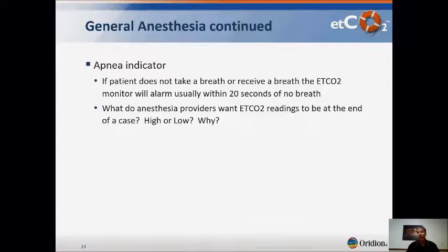So generally you want a higher CO2 reading at the end of the case because CO2 is the impetus for taking a breath. As you're trying to get a patient to wake up, their CO2 builds up, and they'll take their own breath. In fact, CO2 in the brain is basically why you cannot hold your breath and kill yourself, because as soon as you hold your breath, the CO2 starts building in your brainstem, and the brainstem basically says you have to take a breath.